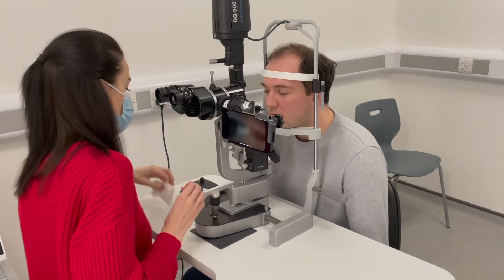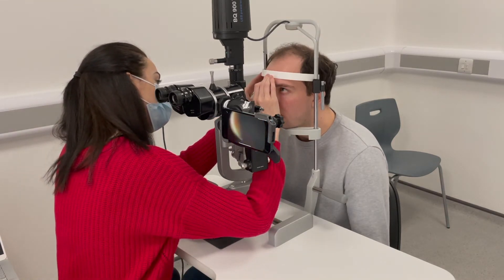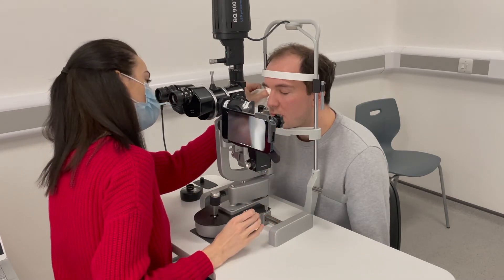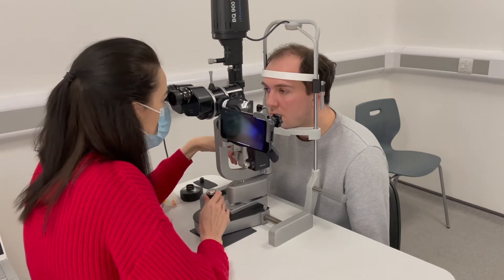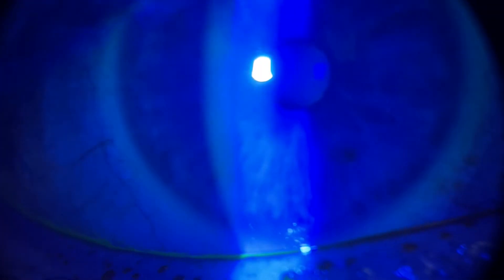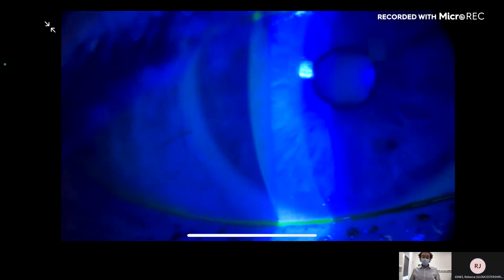Do you mind if I put some fluorescein in? So it's just going to stay on the surface of the eye. Look upwards for me. Maybe a bit of a slightly dry ocular surface there, but it's nothing too crazy. Definitely some blepharitis changes.